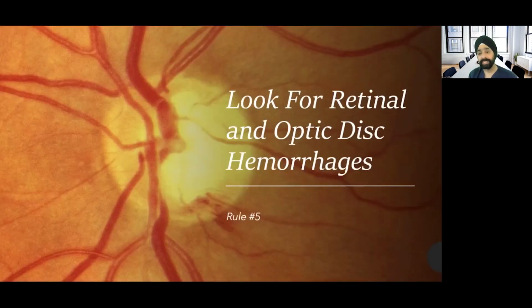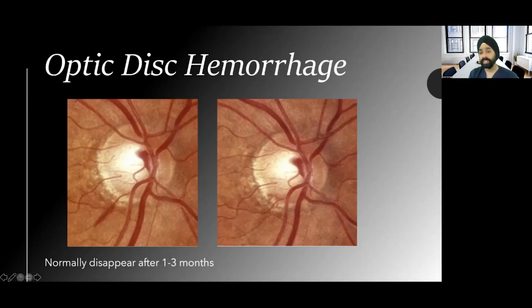Now, don't forget looking for disc hemorrhages. Disc hemorrhages are extremely important, and I look at them like the hemoglobin A1C for the eye for glaucoma, just like we have hemoglobin A1C for diabetes. Disc hemorrhages can really help identify those patients who maybe are not controlled, and they are usually in the temporal quadrants, inferior temporal or superior temporal. They can be a flame type of hemorrhage like here. They can be more of a diffuse blot type of hemorrhage as well. They can even be at the center of the cup near the entrance of the lamina. But the majority of the time, these disc hemorrhages will disappear within about a month to 3 months. So they're not a permanent issue, but it's nice to see.